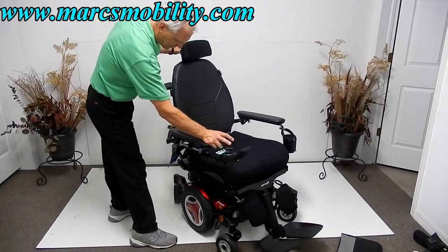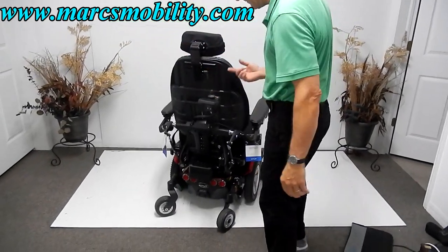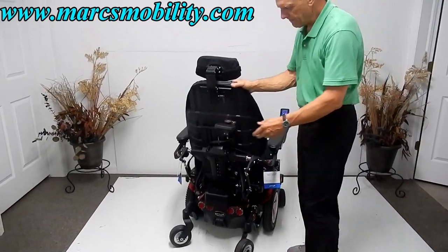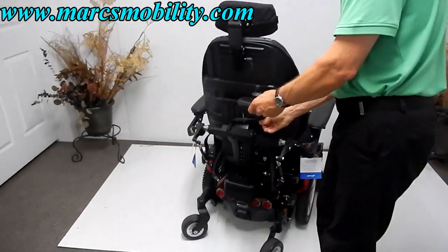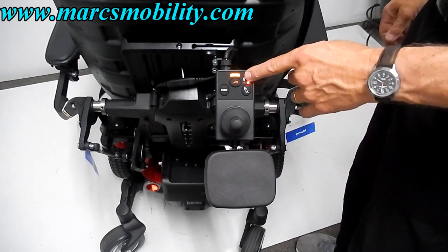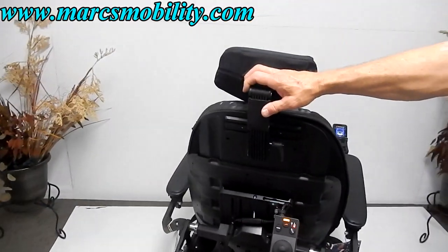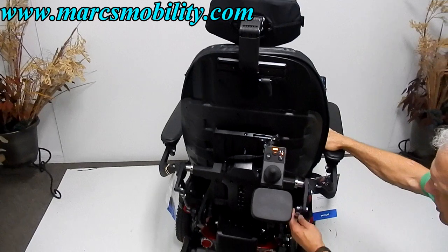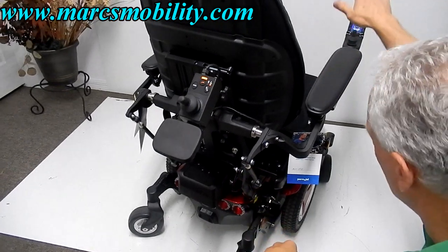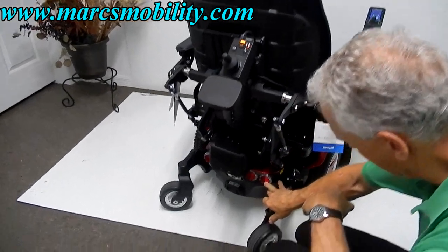These heavy-duty chairs don't turn very well on this mat since it's slippery — the chair is heavy and the suspension is stiff so the drive wheels can spin. You have an attending control here that you can remove if you don't want it, allowing someone else to drive the chair from the back. The headrest is adjustable, and you can adjust the arm height by unlocking and turning these cylinders. This part controls the tilt of the arm.